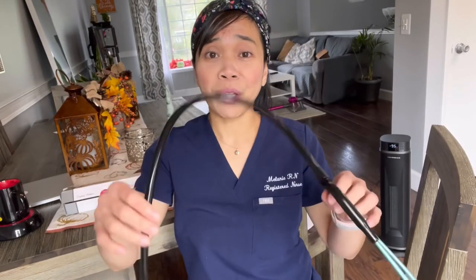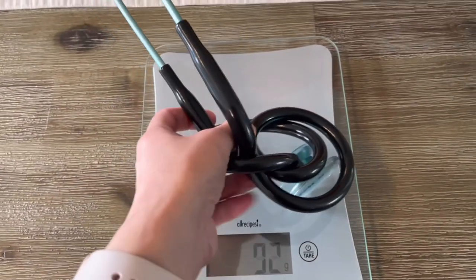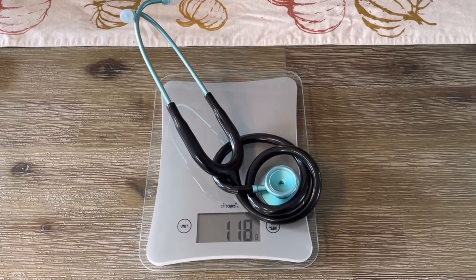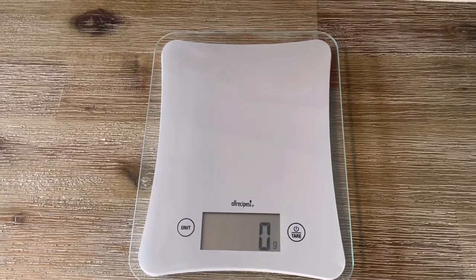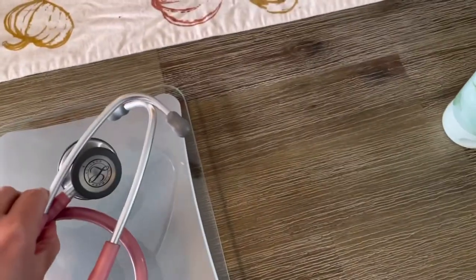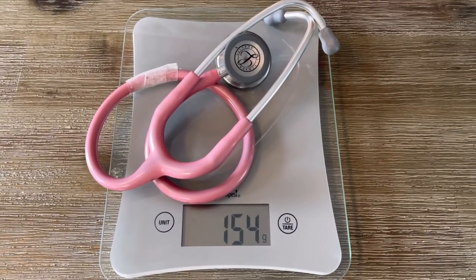This stethoscope is very light and I can put it around my neck for a long period of time without noticing that I'm wearing it. It does weigh 118 grams. I'm just going to compare it with my Littmann stethoscope that I've been using for years — I don't use it anymore because it's broken. The Littmann weighs 154 grams.